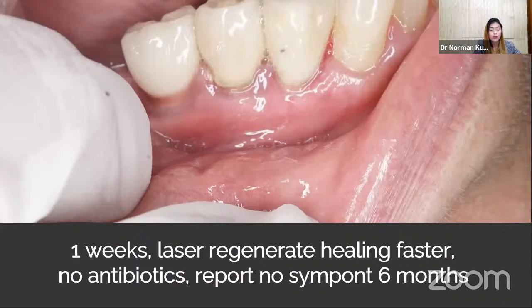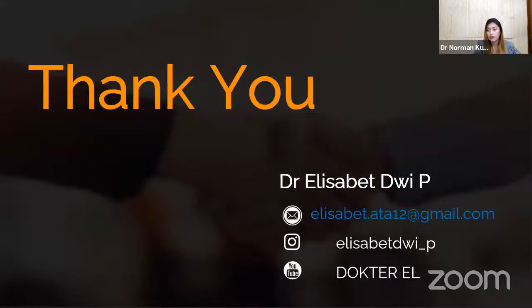So this is a photo a week after the laser treatment, without antibiotics. We could see very rapid tissue regeneration here, the gums recovered very well, and the crown survived very well. After 6 months, there were no symptoms from this patient. So the conclusion is that laser in dentistry provides many benefits, ranging from speeding up our working time to reducing pain, minimizing bleeding, and speeding healing.